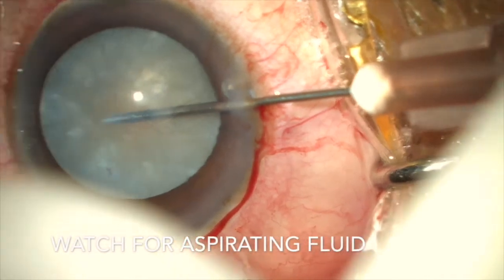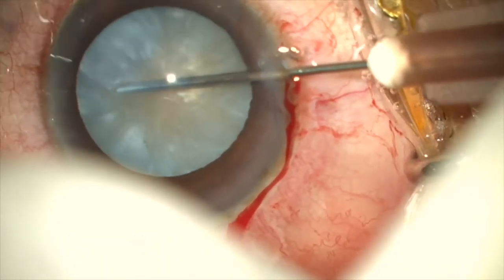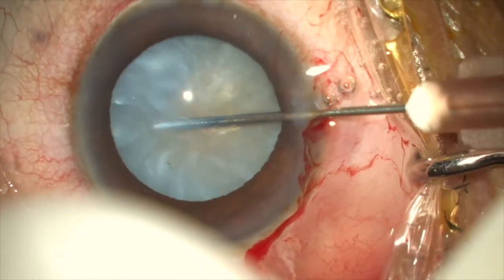When you start aspirating the liquefied cortex, the intralenticular pressure decompresses and the chances of an Argentinian flag sign are nullified.